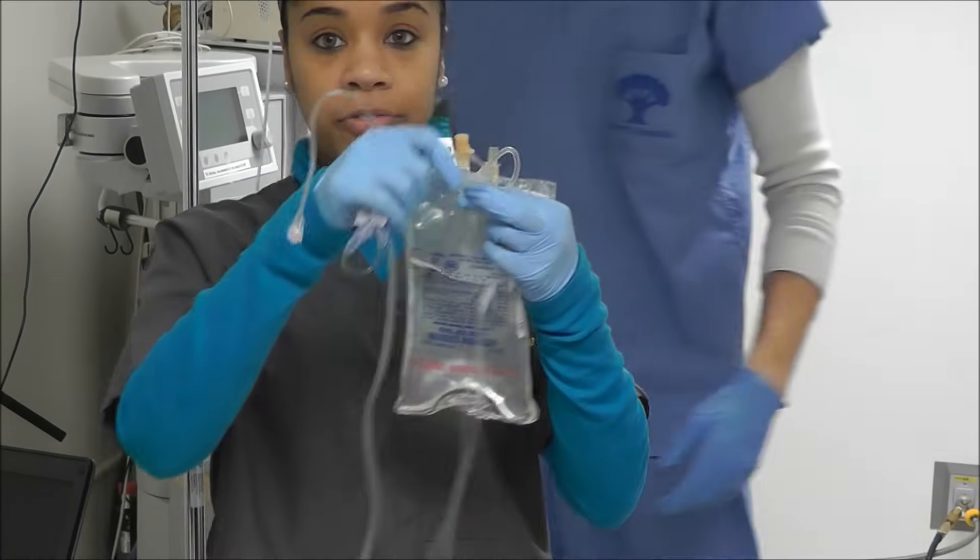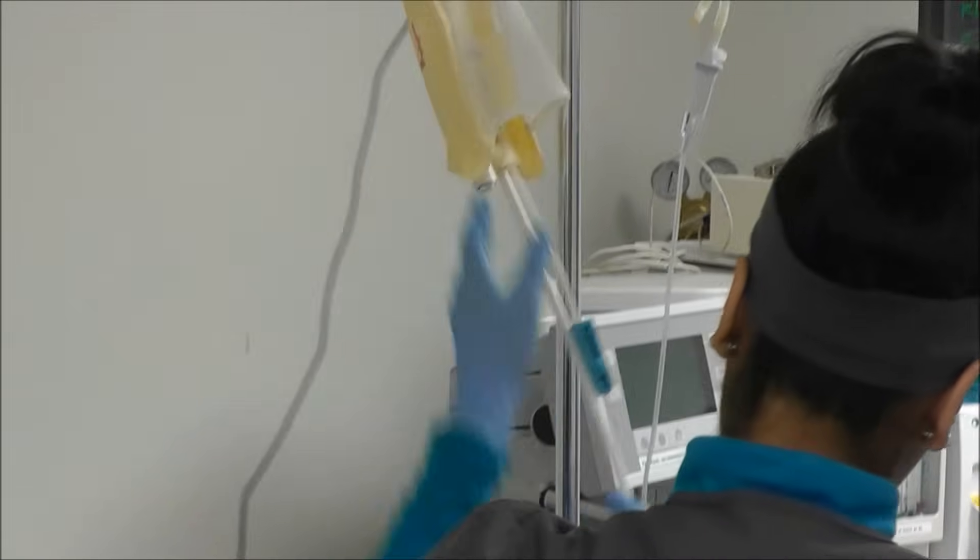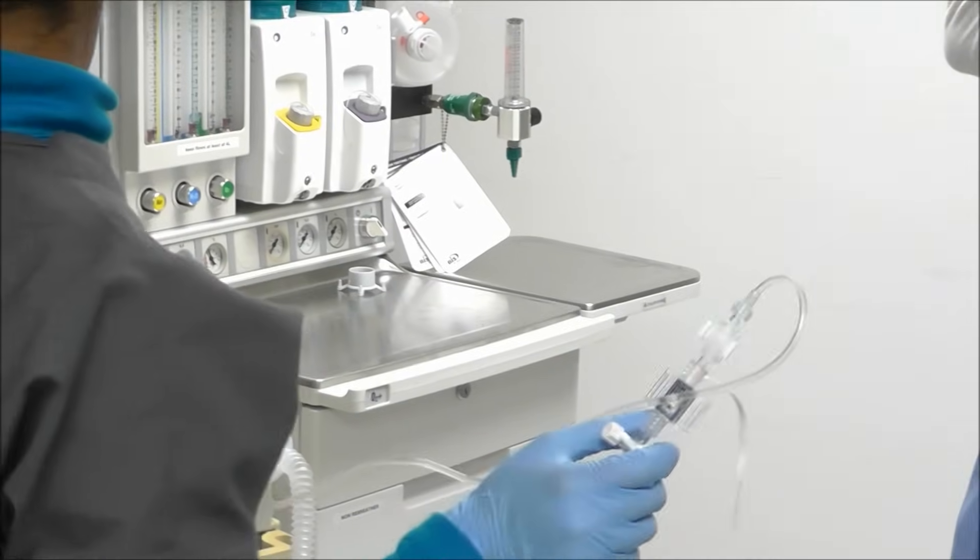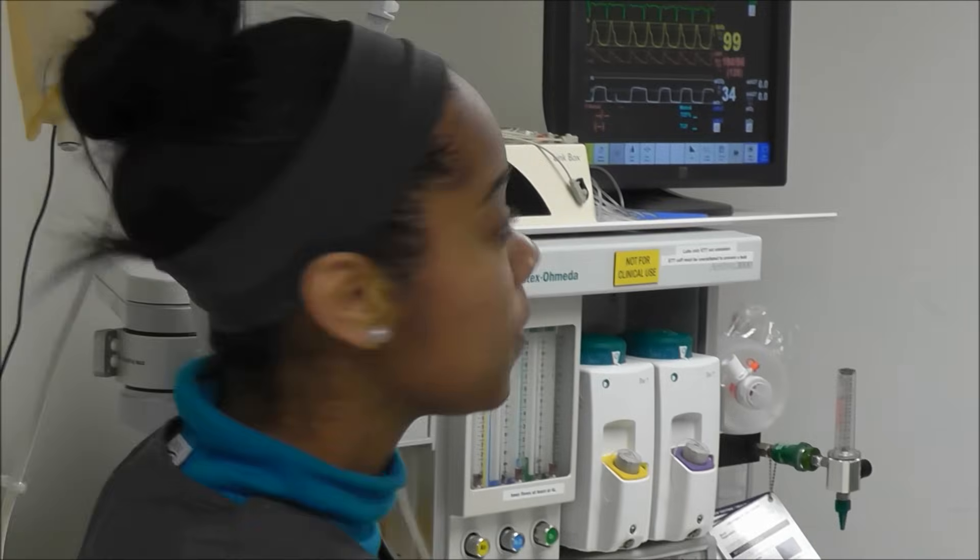First thing you want to make sure you do is flush your tubing. You want to make sure that all your stop cocks are turned on in the right spots and that your roller clamp is open.